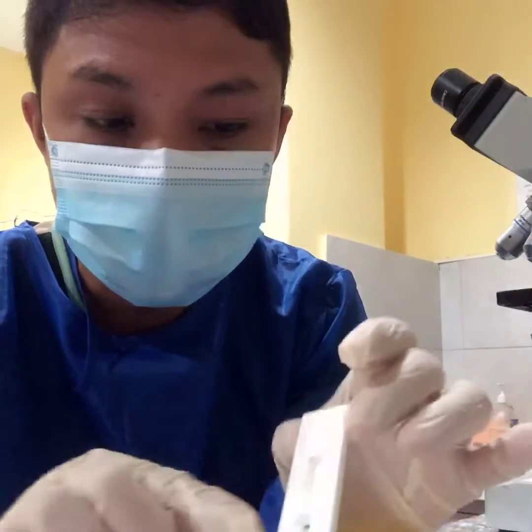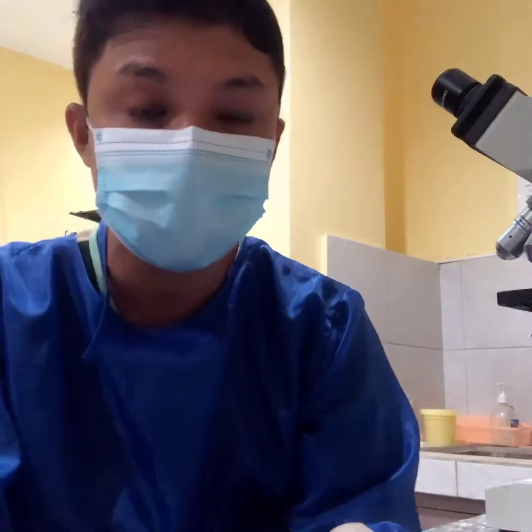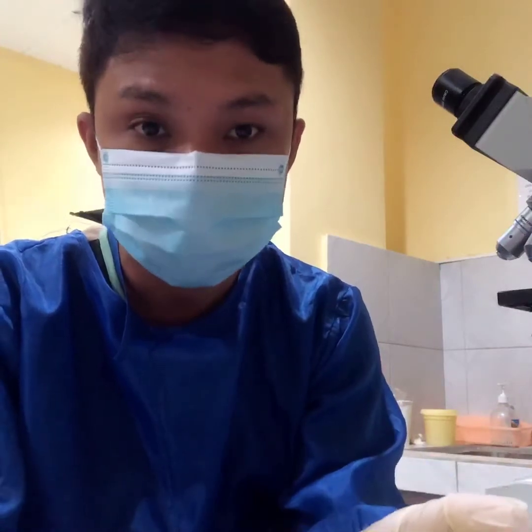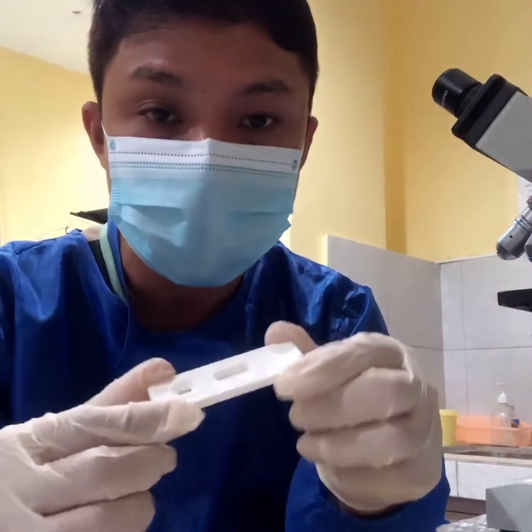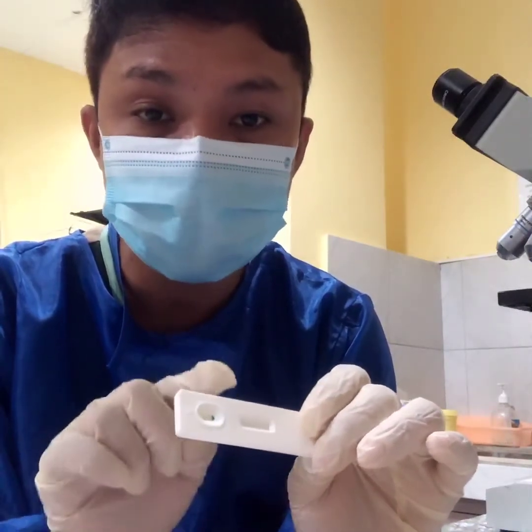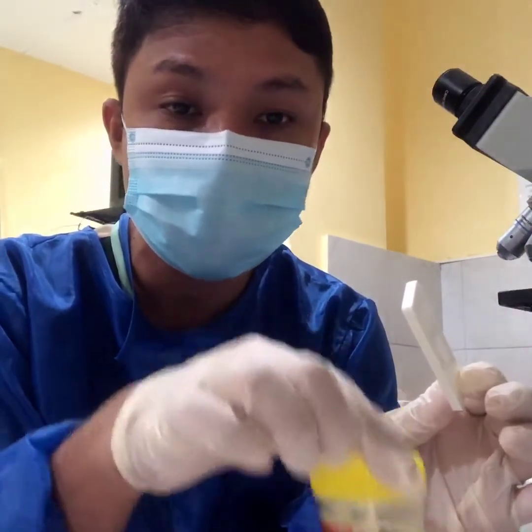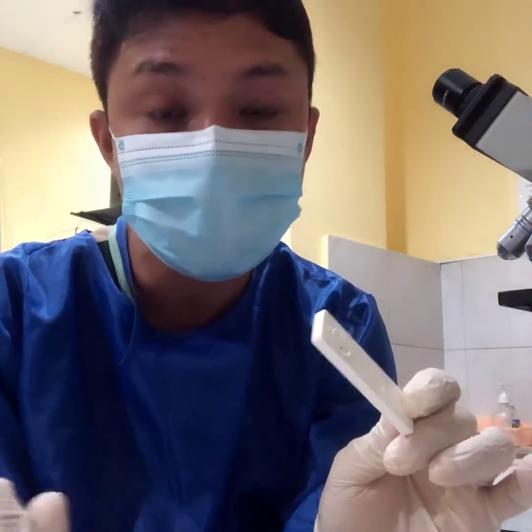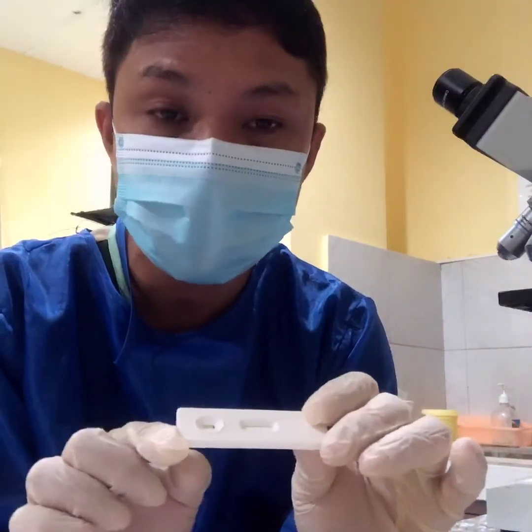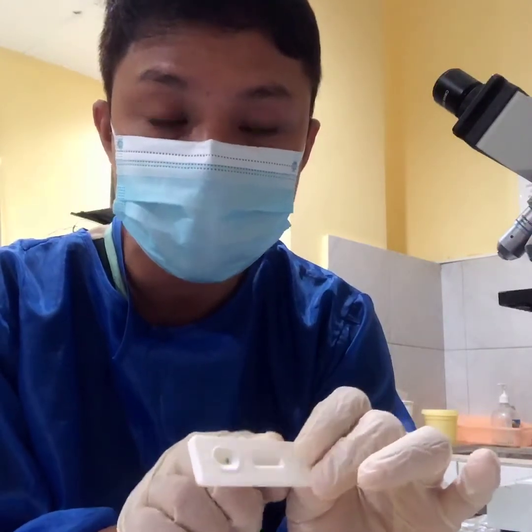It's not very visible, but there's a test area and we also have the control area. Since we are detecting pregnancy, the human chorionic gonadotropin hormone serves as our antigen. Our test membrane is impregnated with monoclonal anti-human chorionic gonadotropin as our antibody, since the antigen we are detecting in our urine sample is the human chorionic gonadotropin. The test membrane is also impregnated in the control area with the monoclonal IgG antibody.